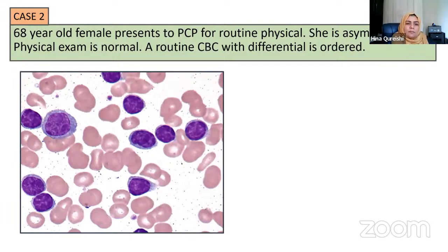So the peripheral blood smear review in this patient is showing many lymphocytes that are small in size. The size is determined by their comparison to red blood cells. The lymphocyte nucleus is usually about the size of a red blood cell or slightly higher, maybe 1 or 2 times the size of an RBC. And these cells have a very round nucleus. They have very dark condensed chromatin. All of these cells, except this one, look exactly like the other. So this is called a monotonous population. And there's this one cell that's slightly larger with a little bit more cytoplasm, which is also an abnormal cell.